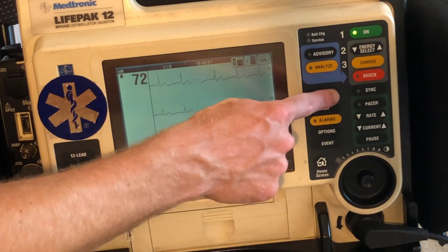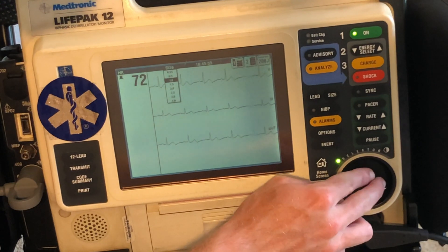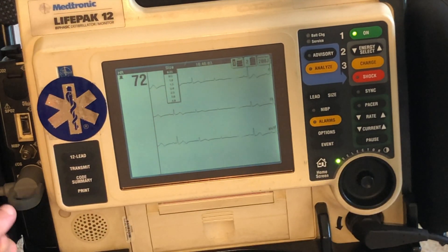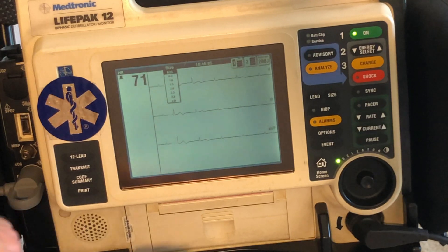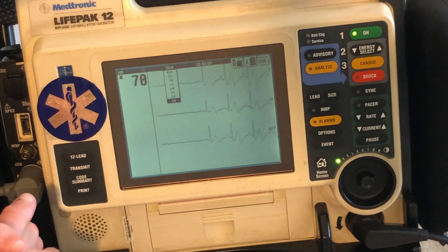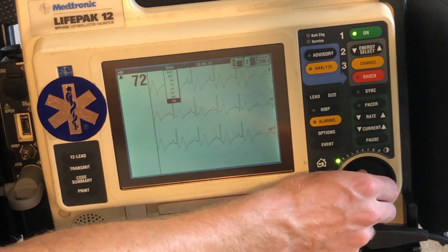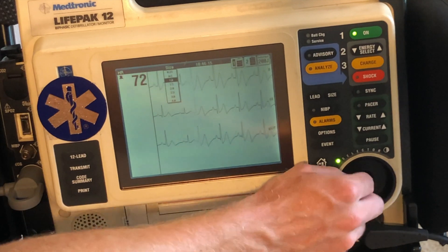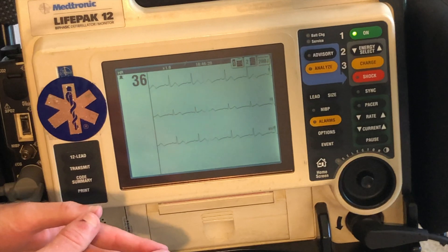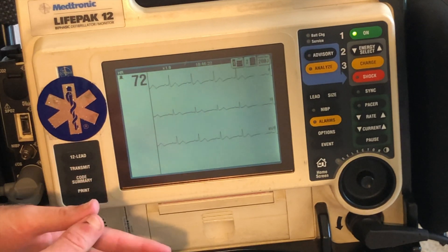Over here is the size. I can change the size of the EKG on the screen — making it smaller or making it bigger. I always recommend keeping it at 1.0, which is what your normal EKG is going to look like. I never mess around with these settings — I usually just keep it at two, three AVF and the size alone.